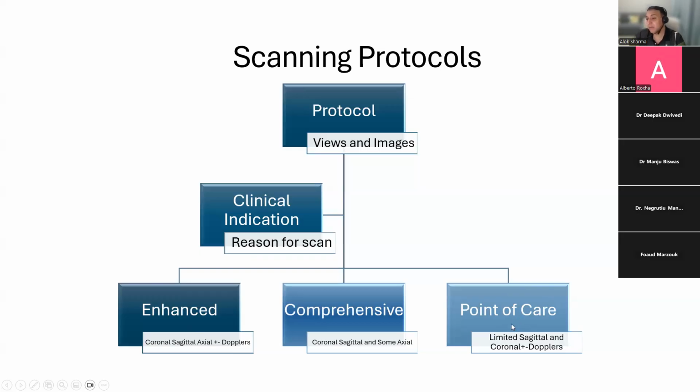often done in an acute IVH in a crashing baby, or if you have a baby with acute hydrocephalus with raised intracranial tension, or a scan that's being done to decide where you want to do the ventricular tap: which of the two ventricles is more dilated, where you're going to get your fluid out from, where the ventricular margin is close to the skin of the baby. Those are point of care indications.